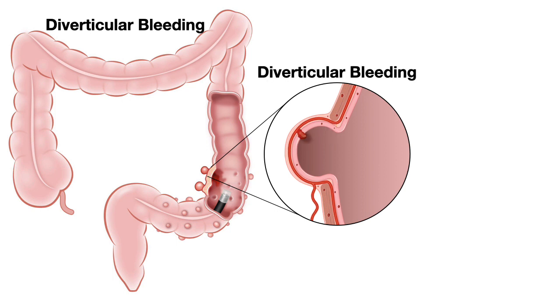So, diverticular bleeding can manifest in different forms. First of all, it is difficult to find the source of bleeding, especially in diverticular bleeding, because of the multiple diverticuli. Hence, it is important to use a cap-fitted endoscope. The cap would allow you to open the openings of diverticulum and peep in to find the source of the bleeding.